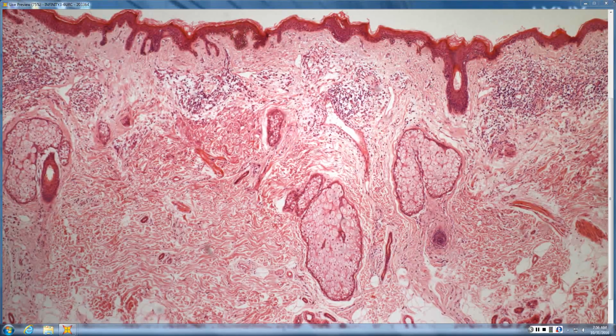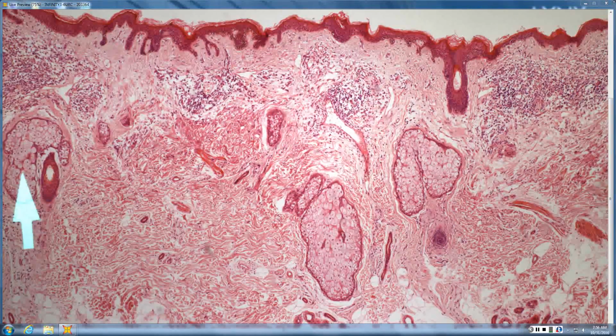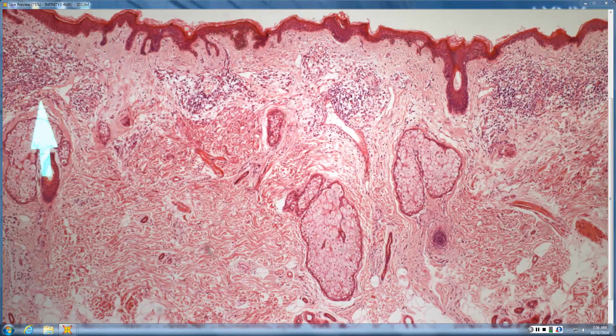You can tell the difference in the vessels because they have a thinner wall and they tend to be a little irregular, just slightly staghorny. All of these things are lymphectasia. The other thing that helps is you have a perivascular infiltrate here around the postcapillary venule. There's really no infiltrate around those lymph vessels, right? They're on the side, so they're not the heme vasculature, they're the lymph vasculature. Okay?